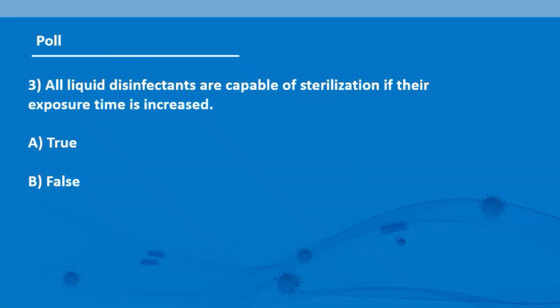Another poll question: all liquid disinfectants are capable of sterilization if their exposure time is increased. True or false? And the answer is false. Only certain high-level disinfectants can achieve sterilization with significantly extended contact time. And this is because most disinfectants are designed to kill only vegetative bacteria, and they aren't capable of killing those resistant spores, which is what's necessary to achieve sterilization.